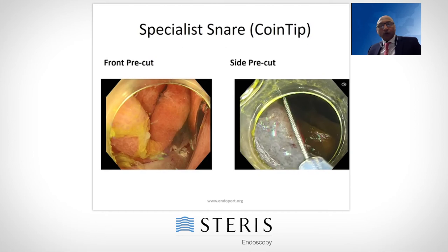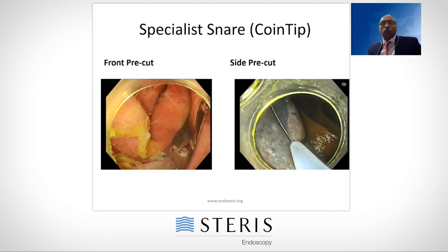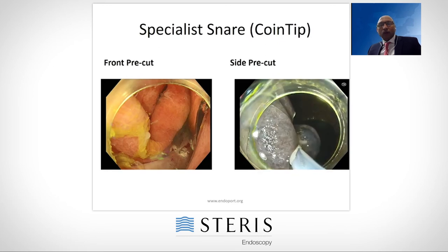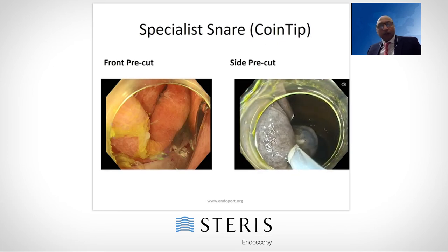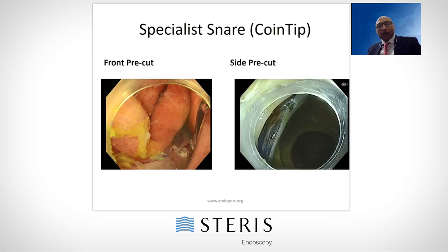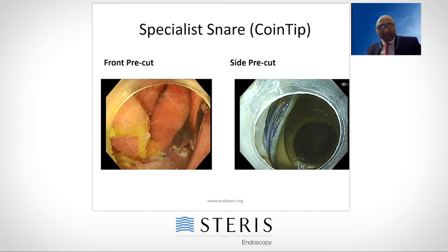Look — my snare is going along the fold, not across the fold, and that is the key to reducing the risk of perforation. We now got the entire polyp again in one bite. It was a fairly large polyp. The snare is flexible, allows me to open slowly to whatever length I want. We've achieved a complete en-bloc resection of this large polyp in the right colon without leaving any residual tissue. En-bloc resection without leaving any island improves the outcome of EMR, and that's where I feel these specialist snares can make a big difference to our practice.